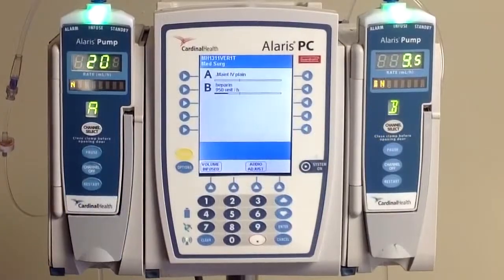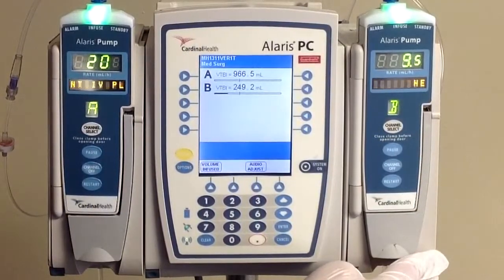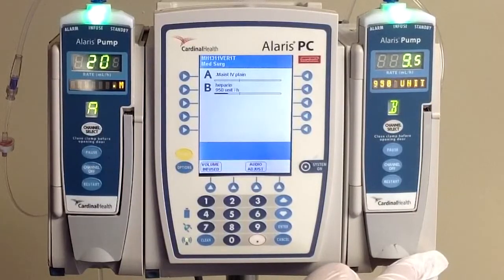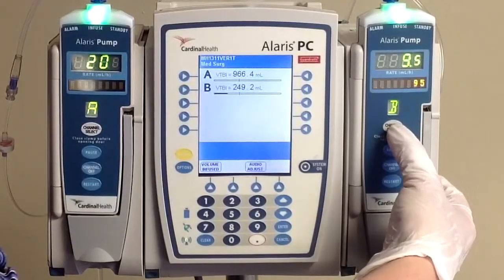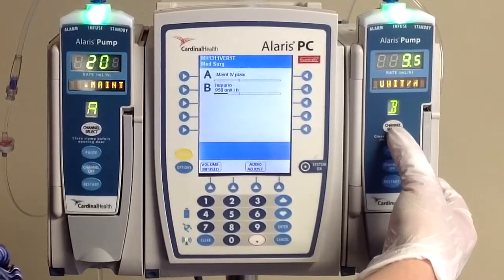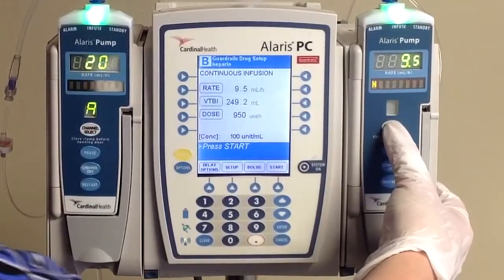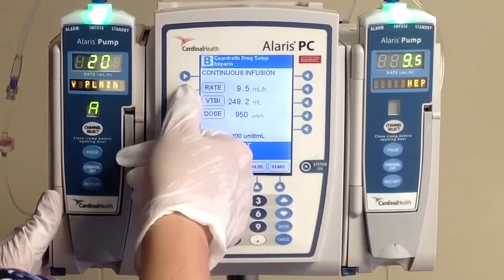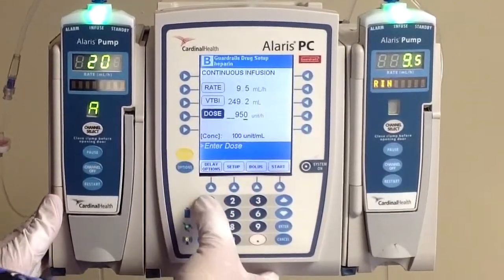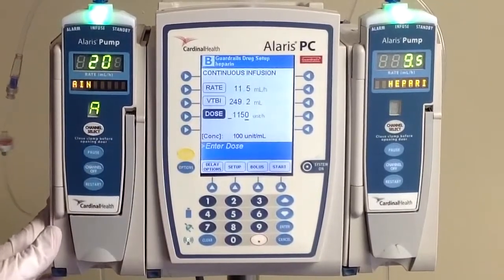By our scenario, we have to change our rate based on the heparin level result of 0.12, which means we're going to have to increase our rate to 1,150 — an increase of 200 units — and we're going to give a 3,000 unit bolus. So let's start by talking to our module, click the channel select, and we're going to start by changing our rate. Increasing 200 units puts us at 1,150, and using our smart pump, it's going to calculate our rate for us.